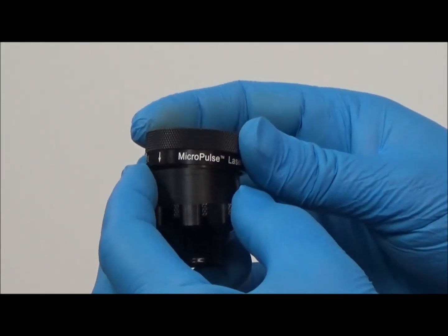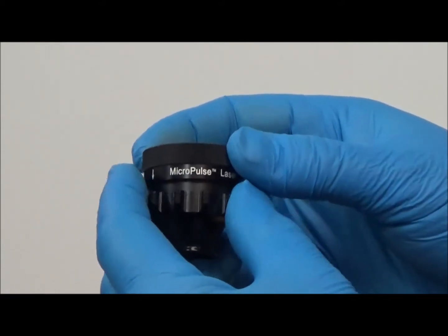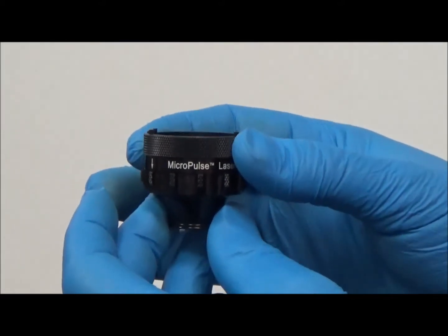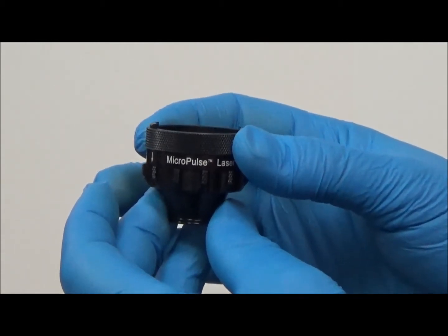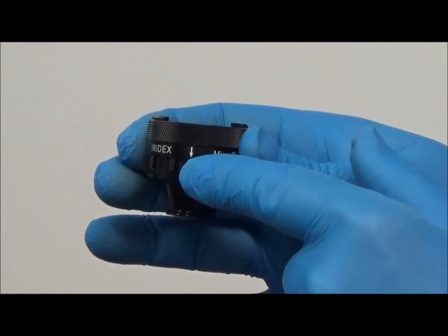To reassemble, simply slide the knurled rim over the tabs until it clicks into place. Note the direction of the arrows on the rim when reassembling — the arrows should point to the lens when reassembled.